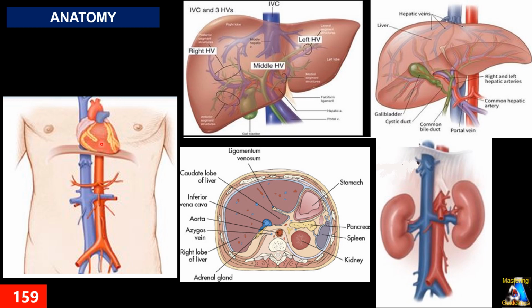As you know, except in situs inversus and great venous anomalies, in the normal situation the IVC is almost at the midline next to the aorta, the IVC on the right side and the aorta on the left side. And they are very close to each other. This schematic makes a little distance, but usually they are in contact next to each other.